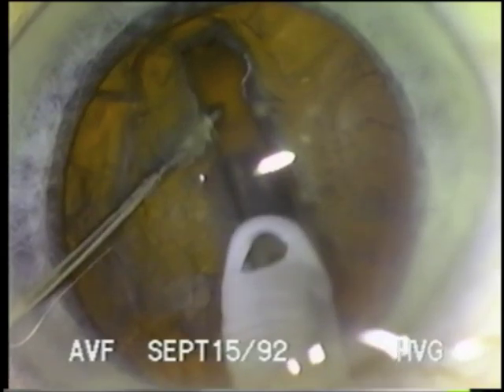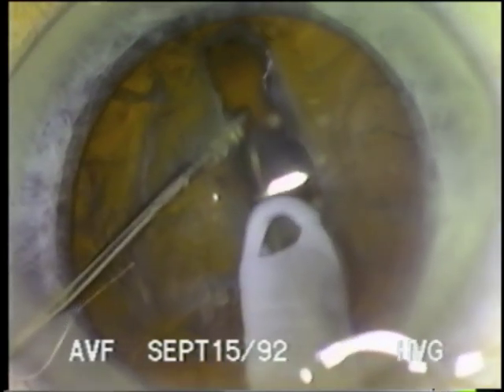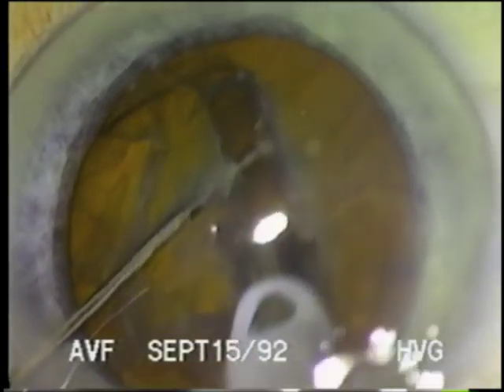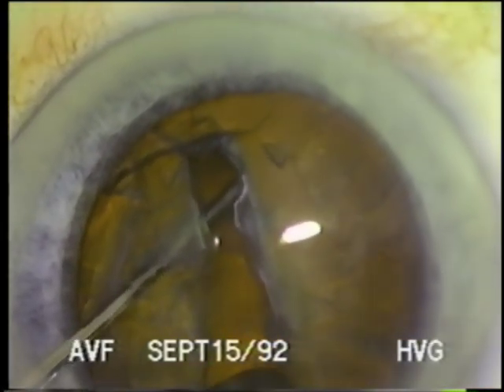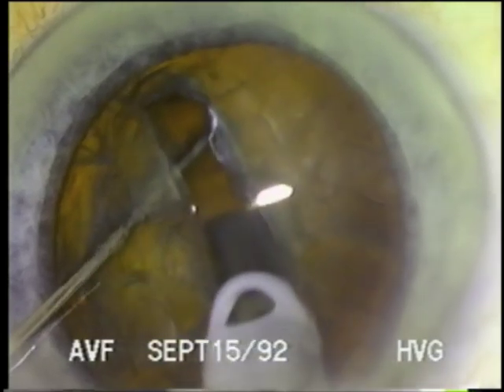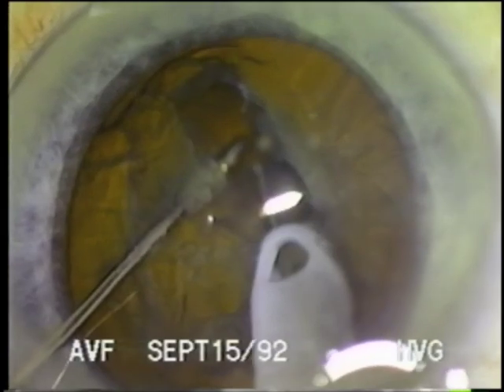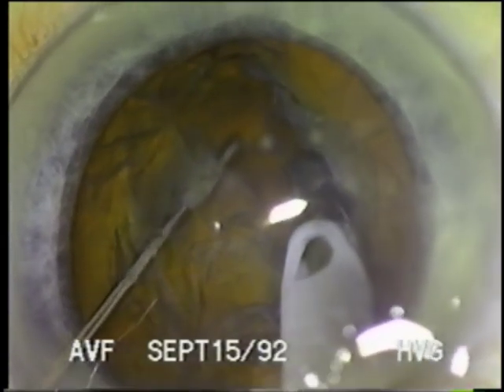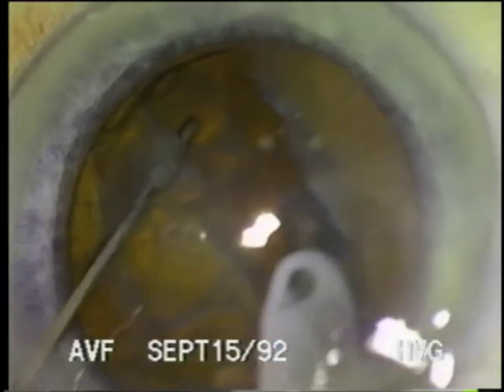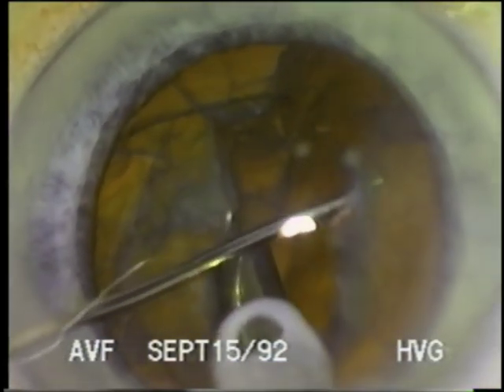Slowing down the video here will give a better indication of what is happening. The nucleus is nudged inferiorly, and the phaco tip sculpts in the upper part of the lens, down the slope of the concave posterior capsule. After a few passes, the instrument tips are placed deep in the nucleus, and fracturing is accomplished while maintaining irrigation and aspiration only.